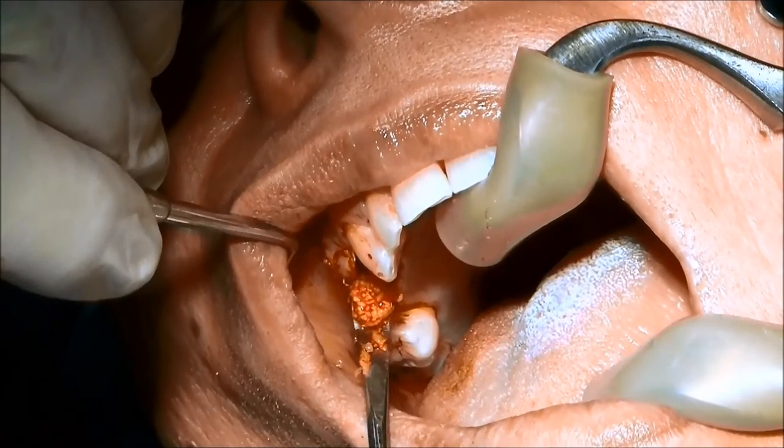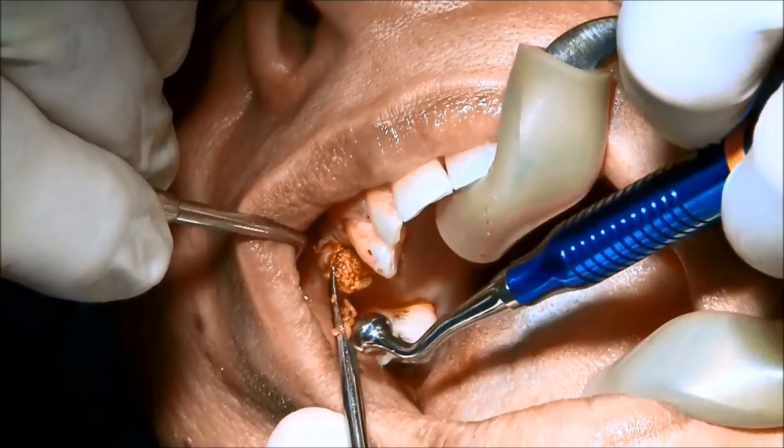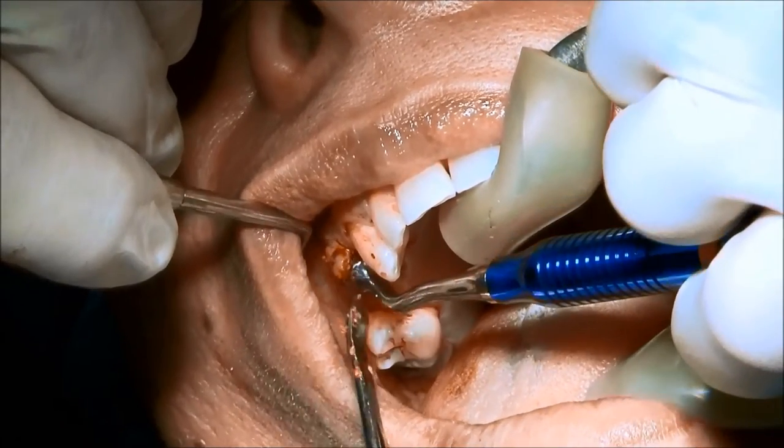We're going to continue placing a good amount of bone to fill all the gap and close that jumping distance on the socket.